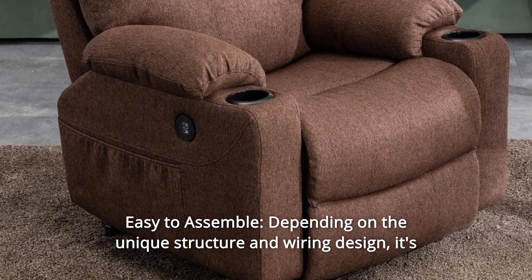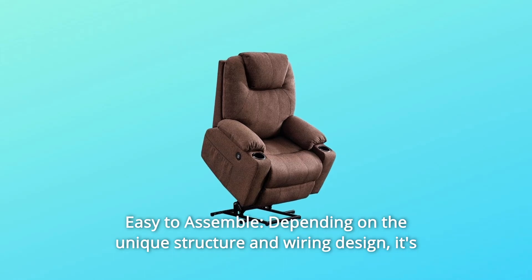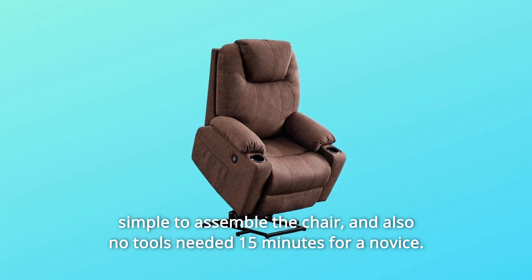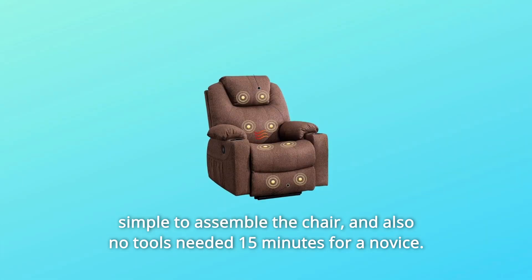Number 2: Easy to Assemble. Thanks to its unique structure and wiring design, it's simple to assemble the chair with no tools needed — just 15 minutes for a novice.